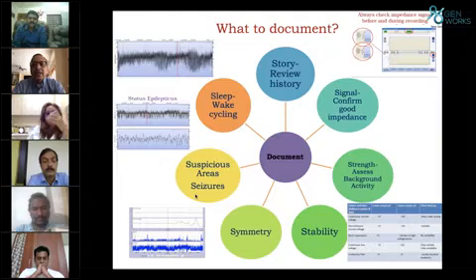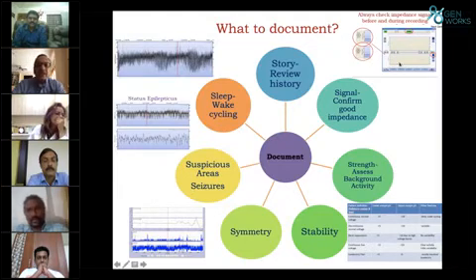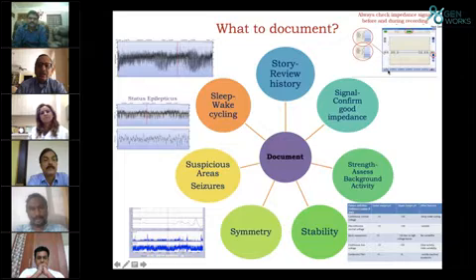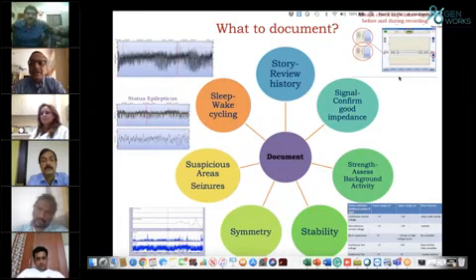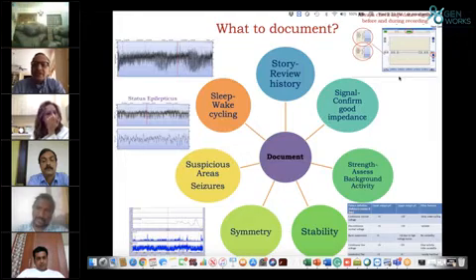And then the background classification, the pattern classification, and it's actually here in the lower right corner. I think Dr. Dinakar will show us how to assess impedance, which is visible on this right upper corner here. On the right lower corner is the background classification. So is this a continuous normal voltage or a discontinuous normal voltage?